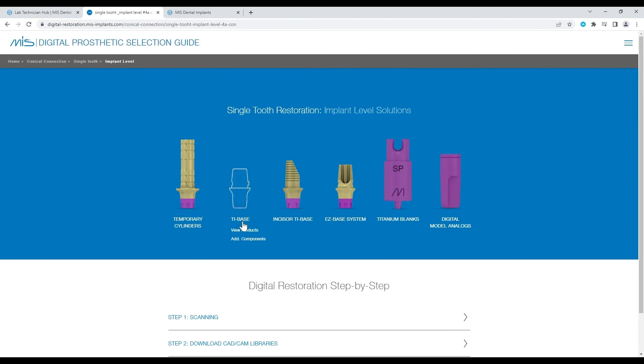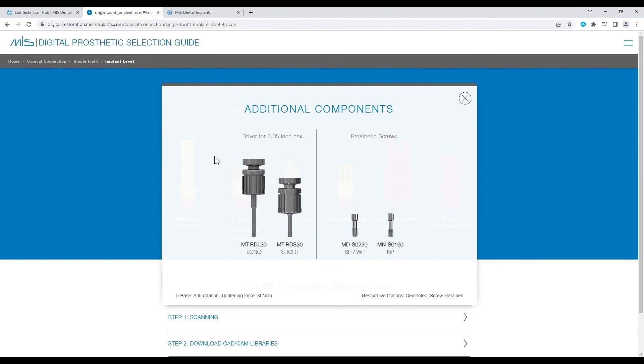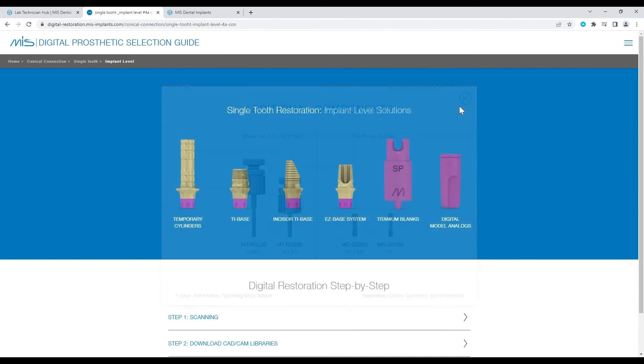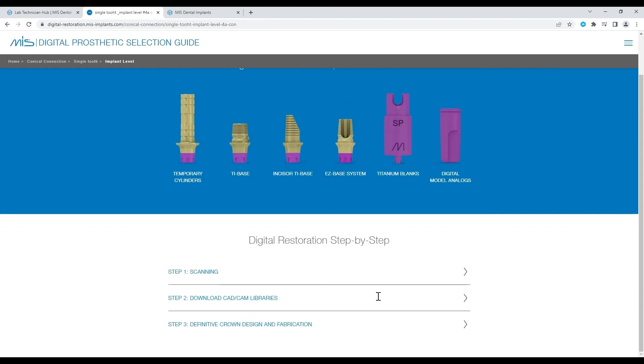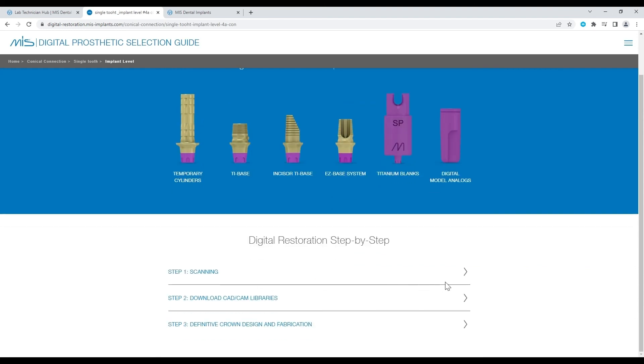Back to the selection guide, click on Additional Components for tools or screws that are required for using the abutment and the desired torque. For your convenience, there's a step-by-step guide for each component.